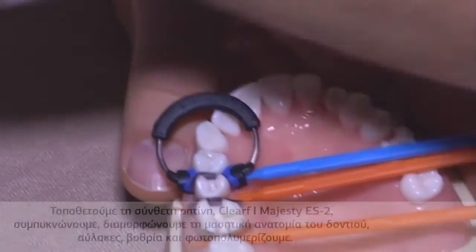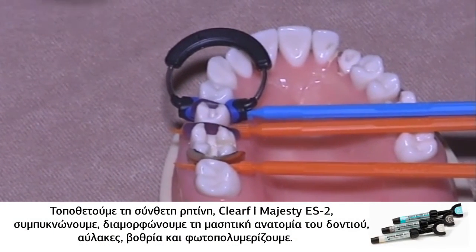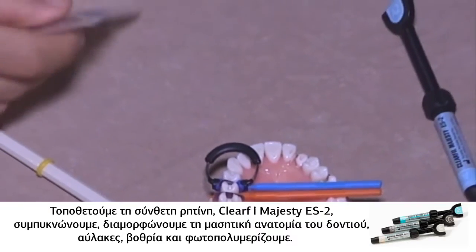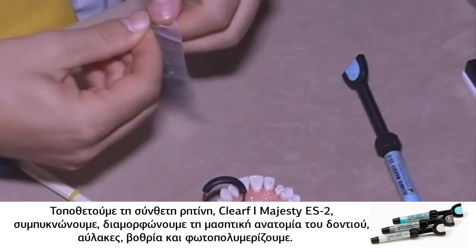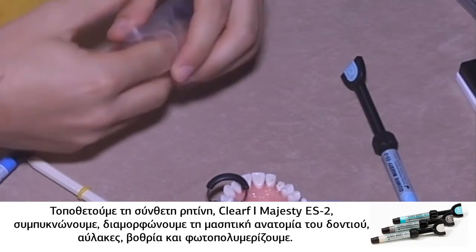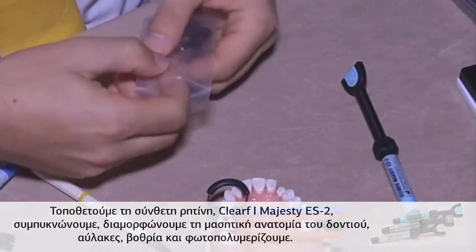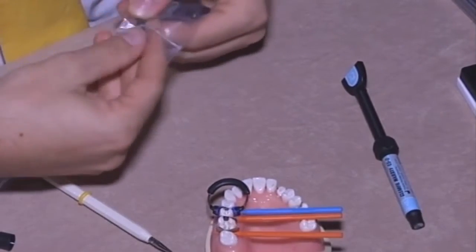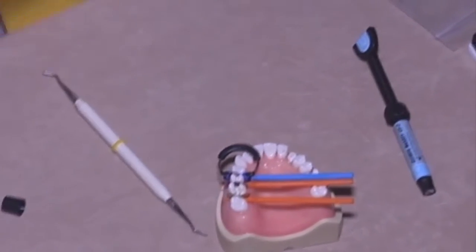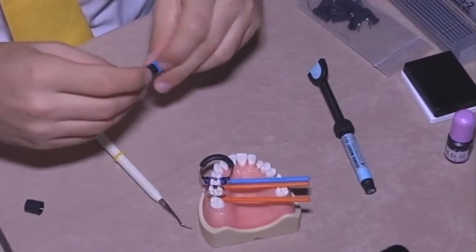And once you light cure, before removing the interproximal matrix, I always suggest placing a thin layer of flowable composite. Flowable composite on the dentin cavity gives you several advantages. You must apply a really thin layer, 0.5 maximum.